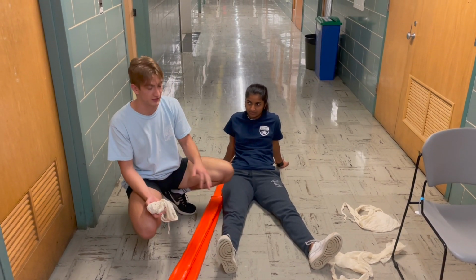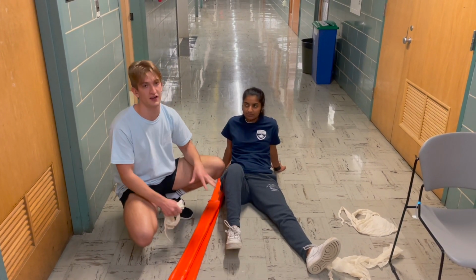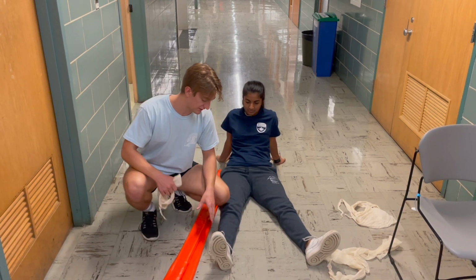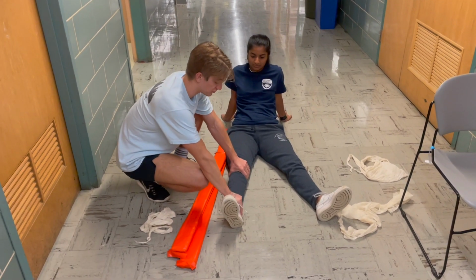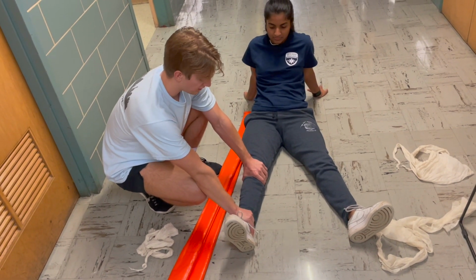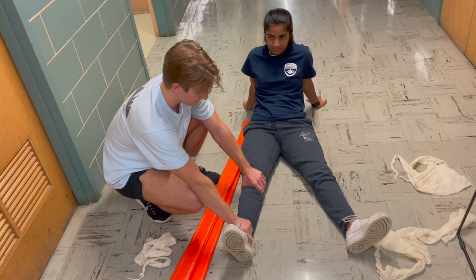we use a traction splint, or a knee injury in which their leg is in a bent position and it's painful for them to move it. So in this scenario, I'm going to say that this patient has a tibia fracture. So we're going to start by taking manual stabilization, the joint above and below, since it's a long bone fracture. I'm going to hand this off to my imaginary patient so I can continue demonstrating the skill.